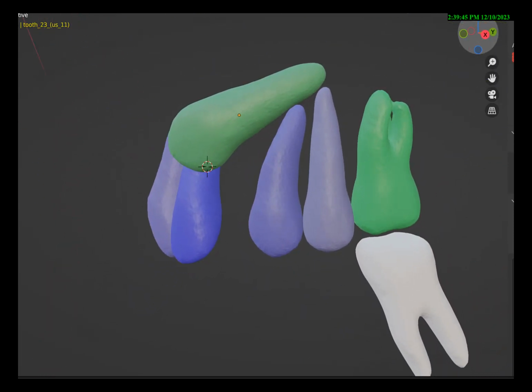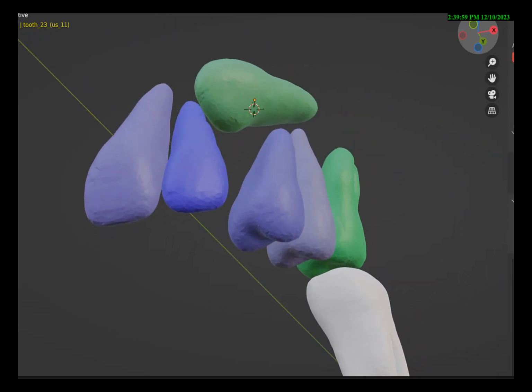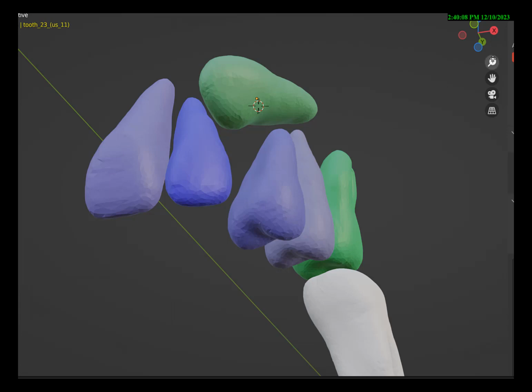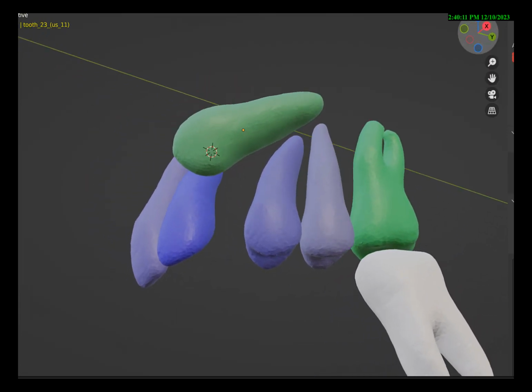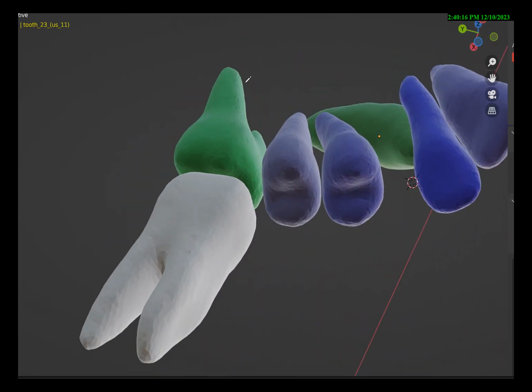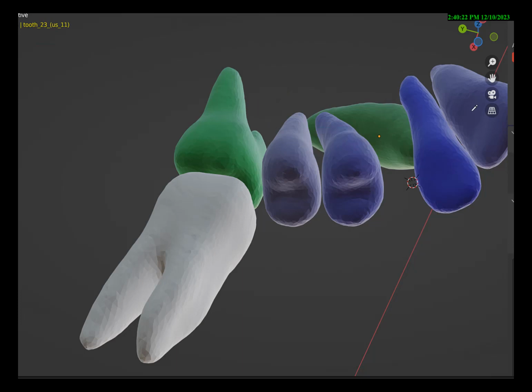The second thing that needs to be looked at is the amount of space available. Many people will run an open coil spring to push these teeth back and this forward, but it's usually not really indicated, because you don't want to move these incisor roots too close to the crown of the canine. So many times a molar distalization procedure may be a better idea, using a lingual appliance and pushing the teeth this way, opening the space without using the incisors as anchorage.